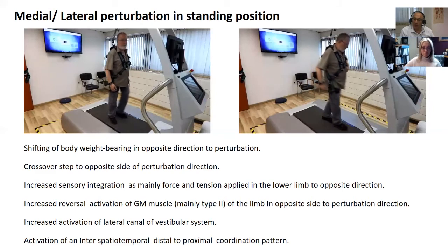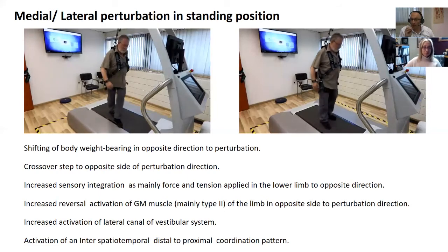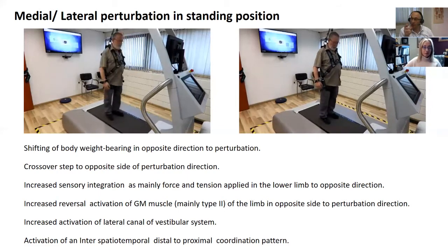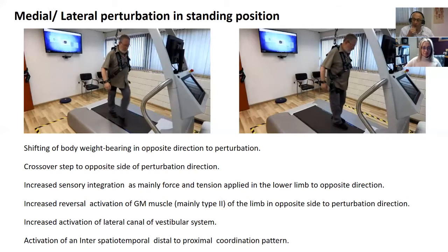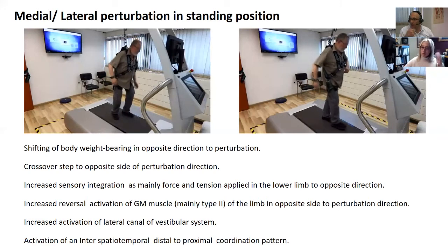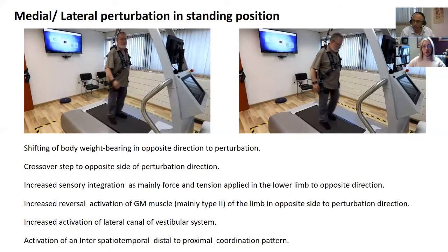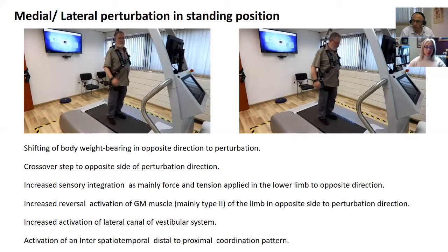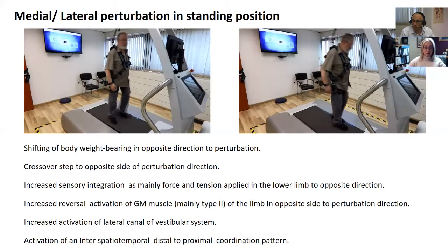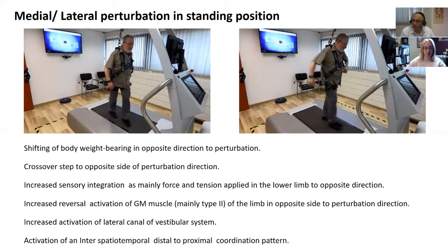The fact that once you've found that customized level, you can repeat it exactly at that customized level. So it's like you found an objective amount of perturbation, and you can repeat that objective intensity of perturbation. So exactly, that's like a reliability of giving a certain amount of perturbation. Right. And the fact that there's carryover to real life. So if he were to, by accident, walk down a sidewalk and trip a little bit, that over time should kick in, that he can take a step and he knows he's comfortable because he's done it before. Right, so yes, that's excellent.